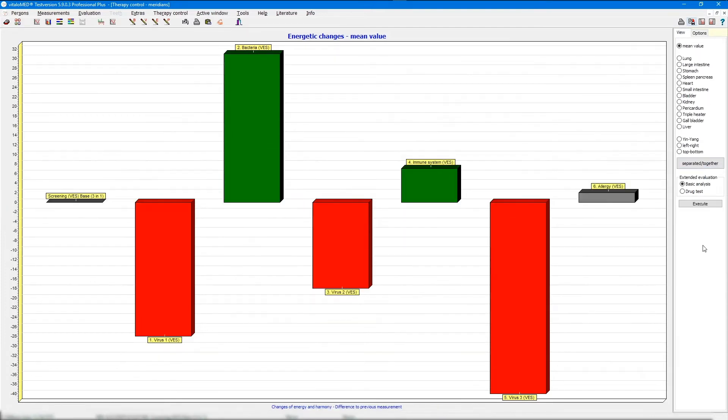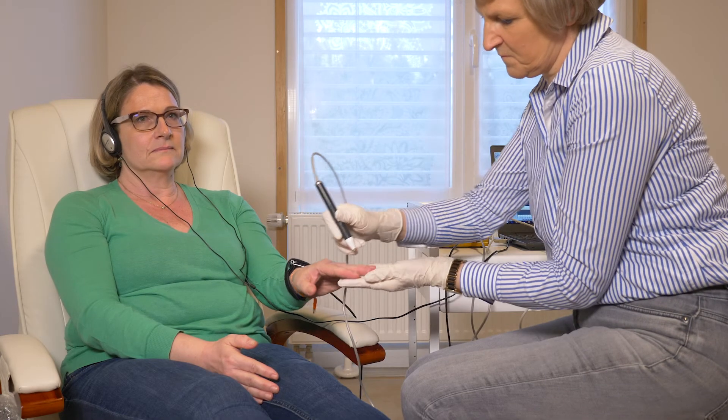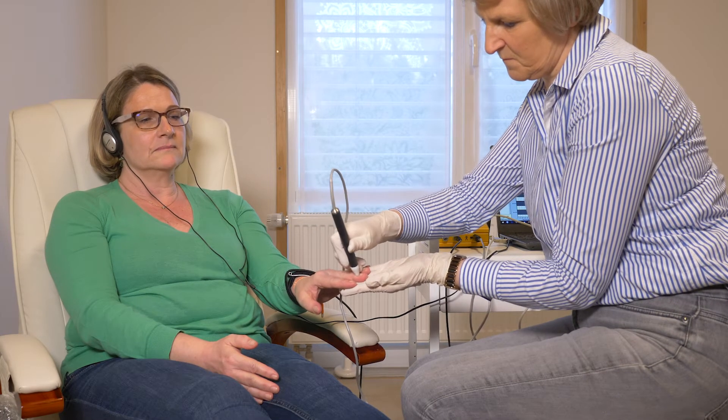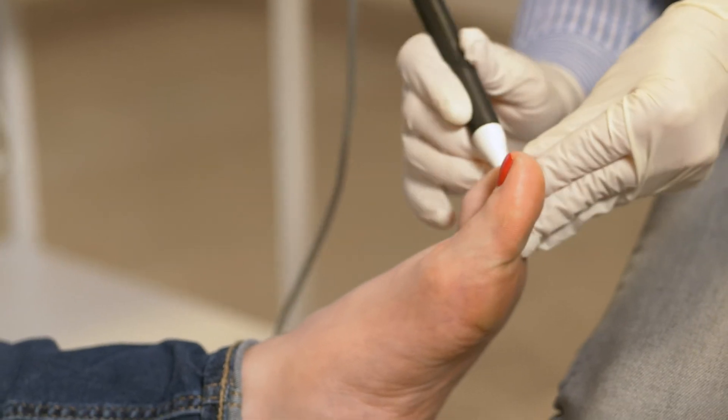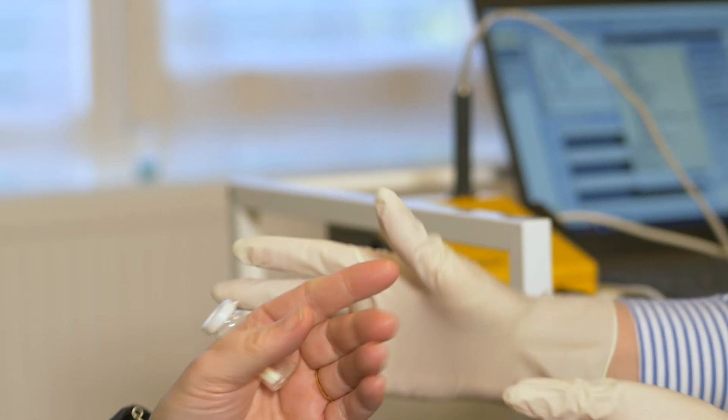After interpreting the graphic, we can now choose the different preparations for the patient. The drugs that are not to be tested are easily excluded with a double click. The measurements start again on the 24 points. In addition to virtual testing using frequency spectra, the software also offers the option of manually testing existing preparations in clinics or practices.